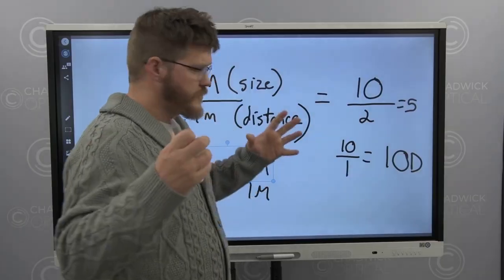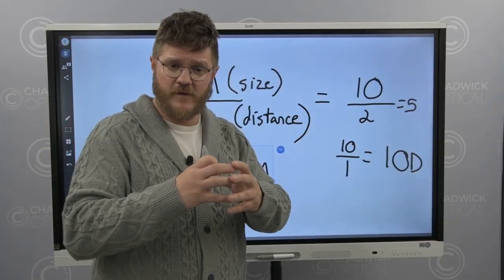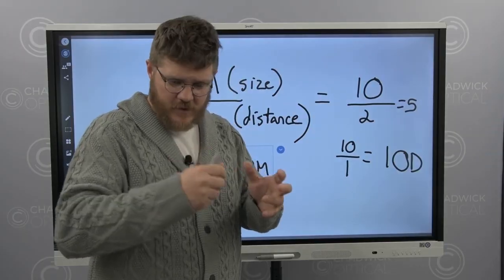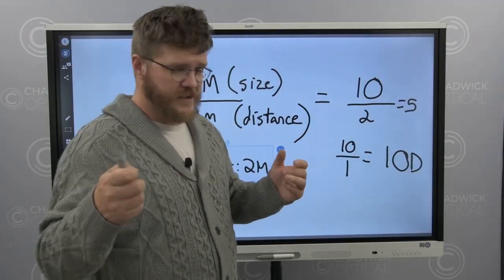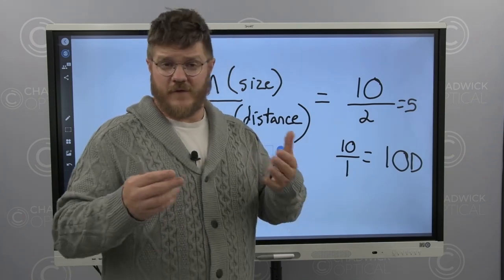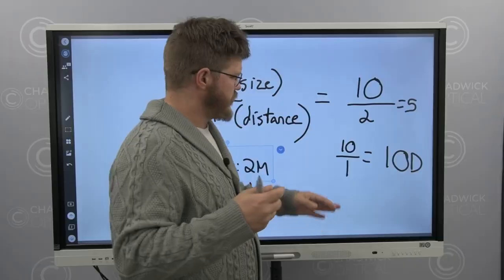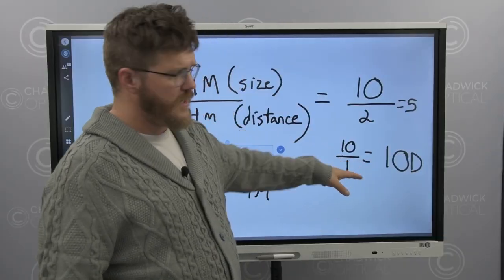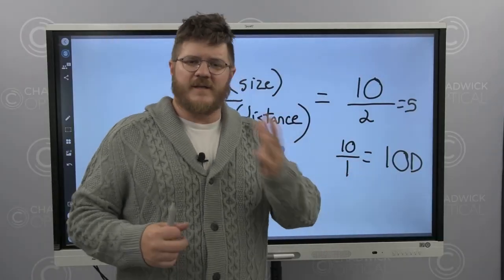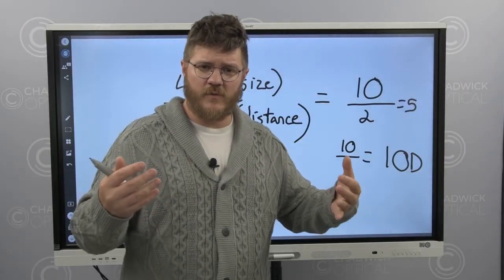And if you overcorrect yourself, you'll shrink the field of view to a point where you'll have to be looking at just a couple characters at a time. So what you want to do is find this number, and then if you can, experiment around either side of it and see what works best for you. In the case of a 10 diopter, you might try an 8, a 10, and a 12 and see what task you're trying to accomplish and what works best.